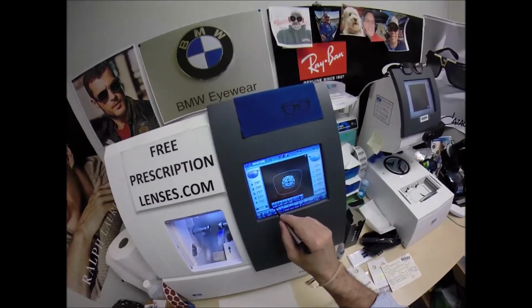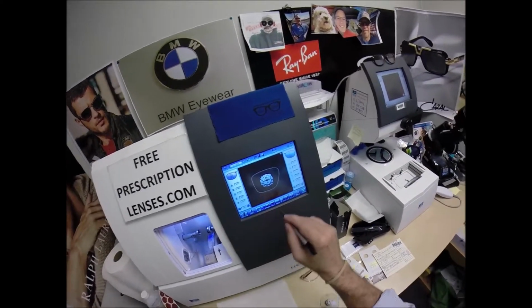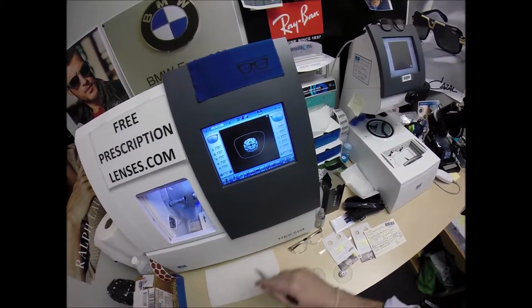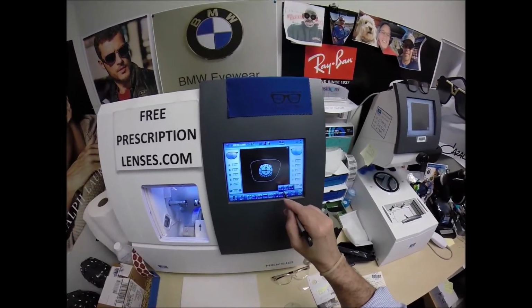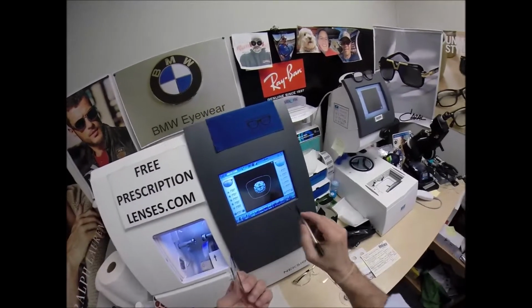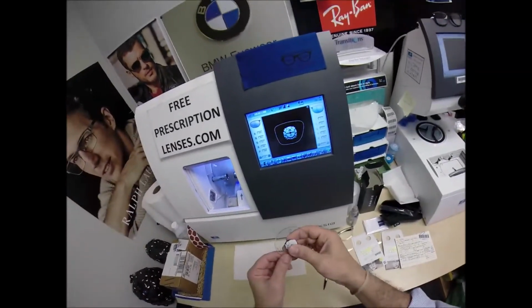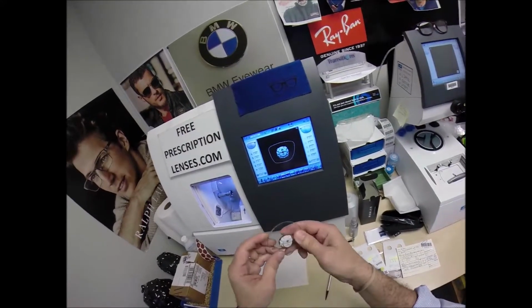So these are polycarbonate lenses. If they were plastic, high index plastic or Trivex, I would select that. I'm not going to polish the edge of your lens because it's not going to be seen. I'm not going to put a safety bevel on the front convex surface of the lens, but I am going to put one on the rear concave surface of the lens. Press the sticker on there firmly, place the magnet.